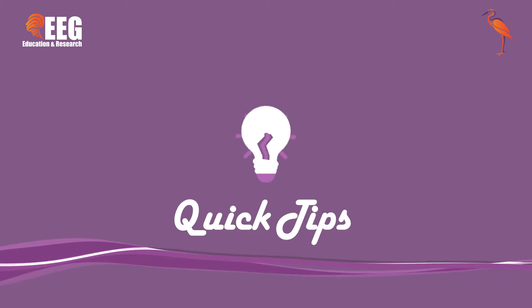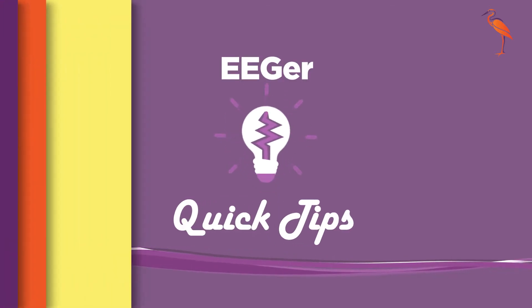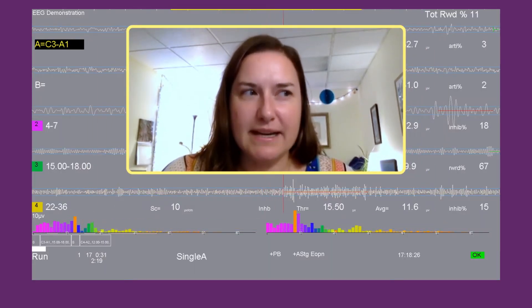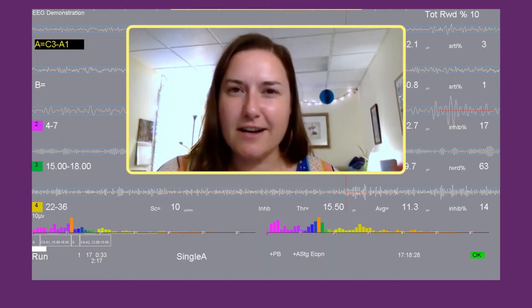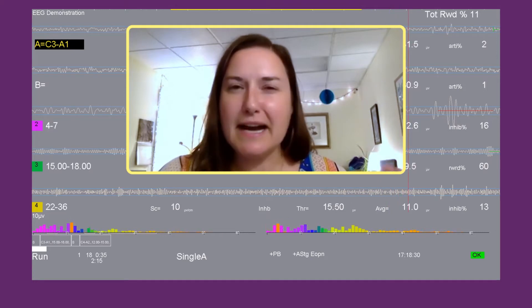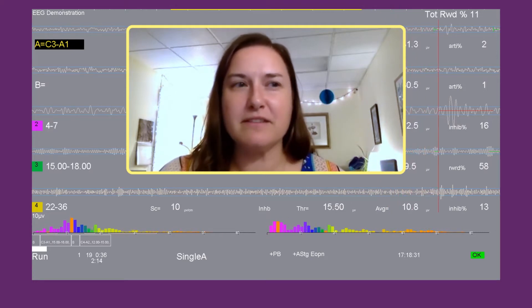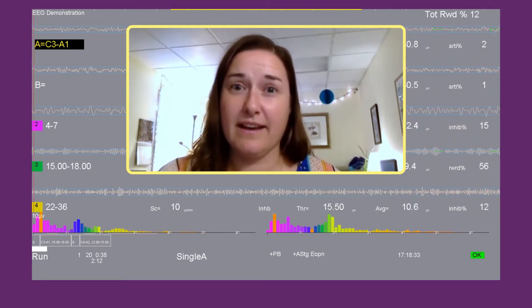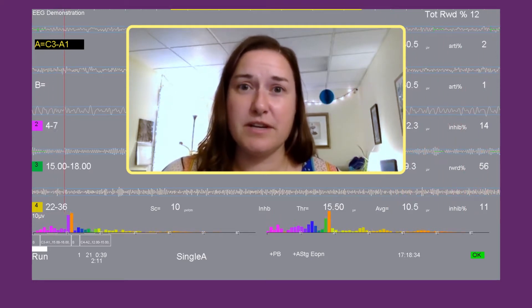Hello, Eagers. Welcome to the Eager Tips videos. Today, we're going to talk about the small but mighty spectral display on the therapist screen. I call it small but mighty because it is this unassuming but highly informative feedback that we get on our therapist screen.